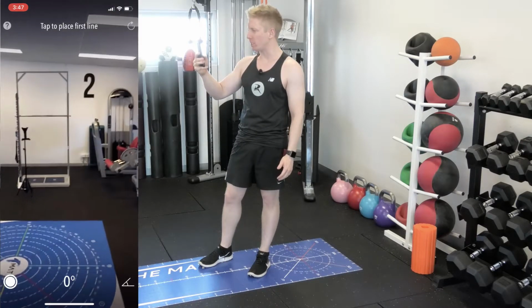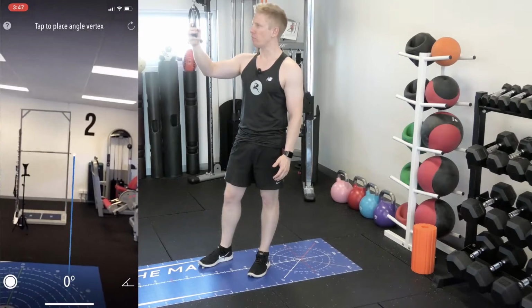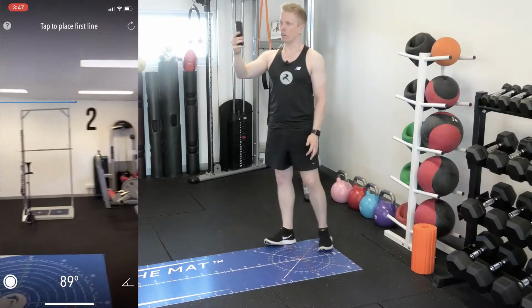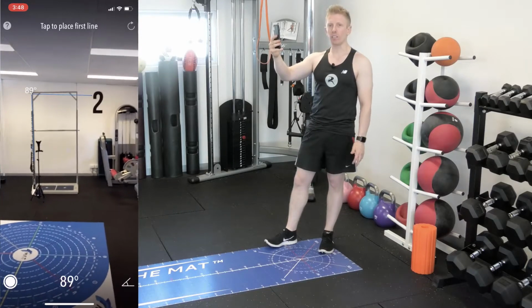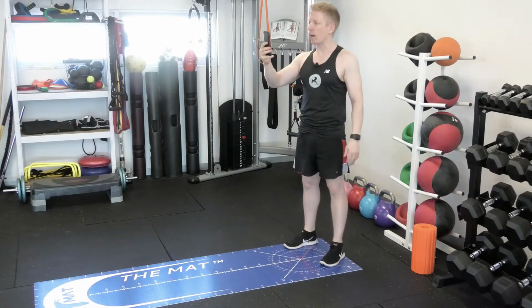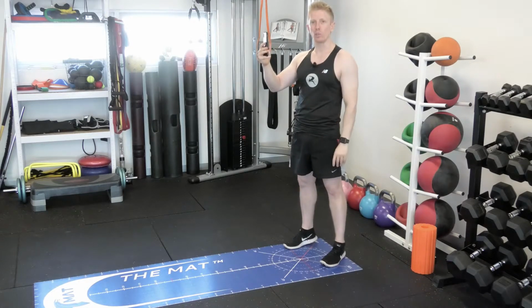So I'm just going to pick a point in space here, and then I'm going to draw a vertical line straight up there, and then I'm going to draw a line across. And so what I could do is I could easily step back and I could start to see this with augmented reality, the angle of the range of motion. In this case, it might be something standing up, like a glenohumeral abduction angle. So a really nice way to start to measure angles using augmented reality.